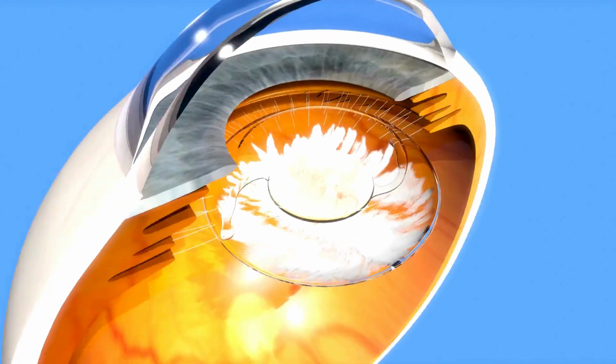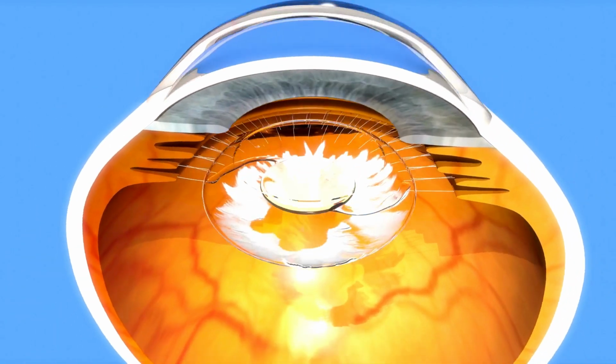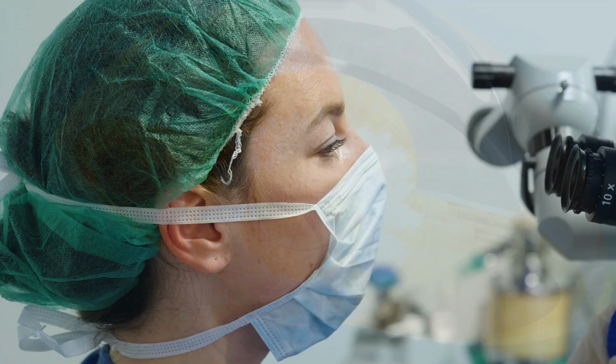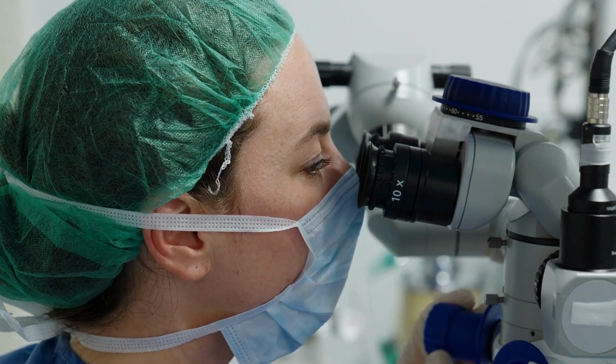YAG laser capsulotomy is a treatment for posterior capsule opacification. The ophthalmologist aims the laser to create a small opening in the cloudy posterior lens capsule, allowing light to shine through and restoring vision. The ocular lenses sit behind the iris and pupil.